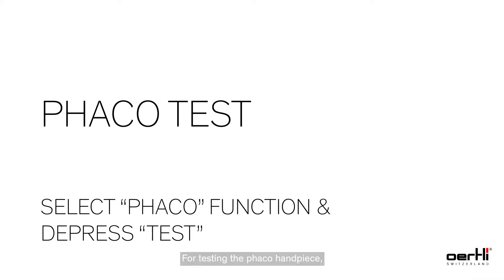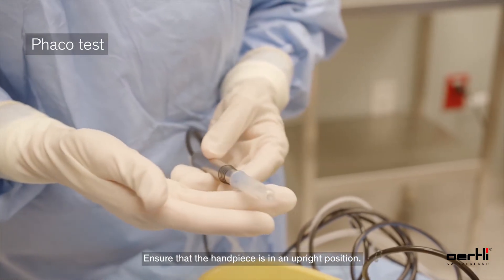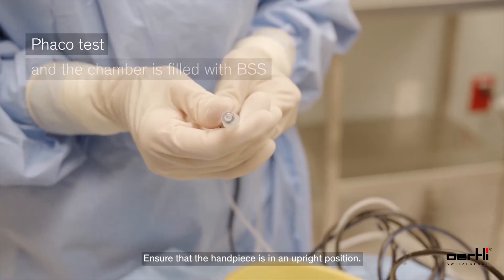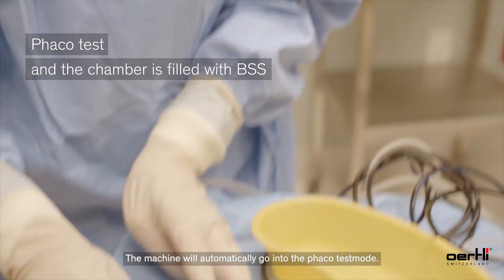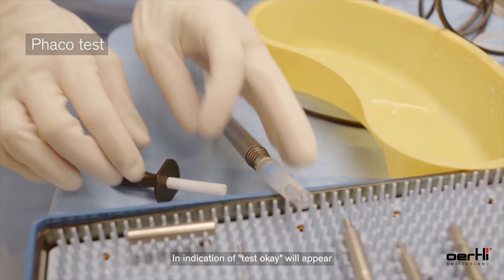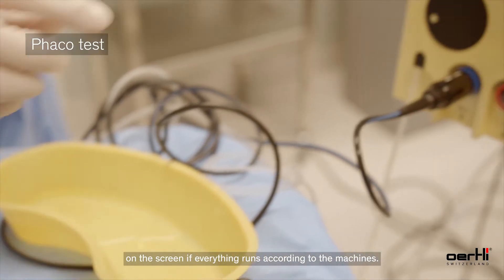For testing the phaco handpiece, ensure the test chamber is securely on the phaco handpiece and that the handpiece is in an upright position. The machine will automatically go into the phaco test mode. An indication of 'test okay' will appear on the screen if everything runs according to the machine's parameters.